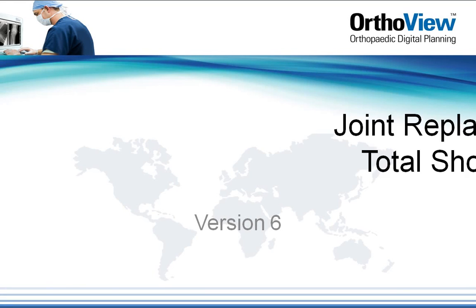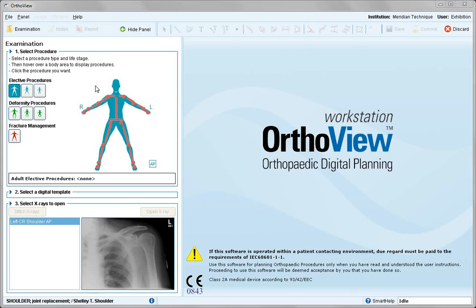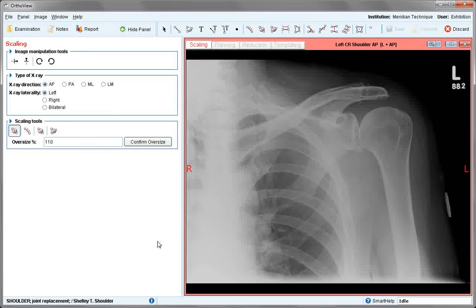In this tutorial we review the total shoulder replacement procedure. From the elective menu, choose the shoulder joint and the total shoulder icon. The favourite template appears, correct x-rays selected, open the x-ray.